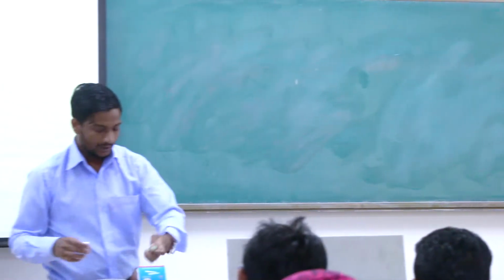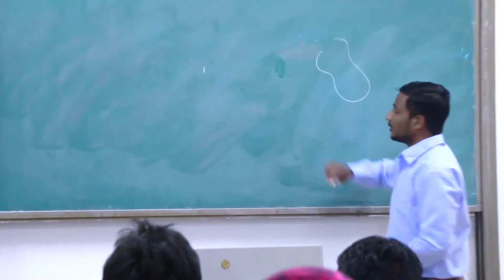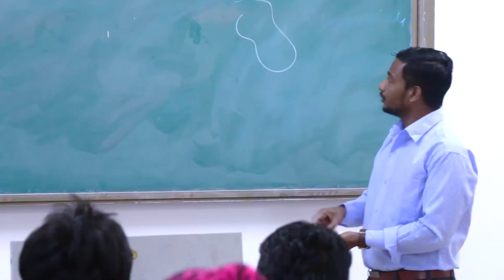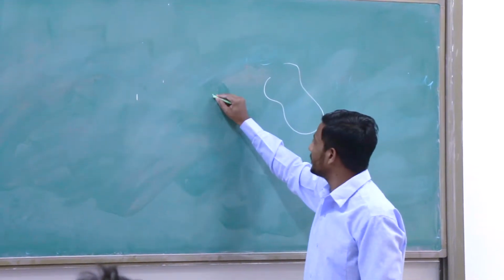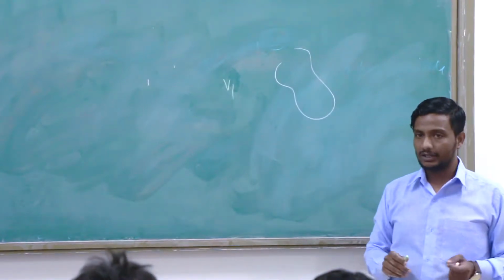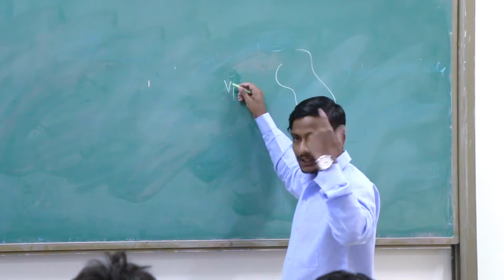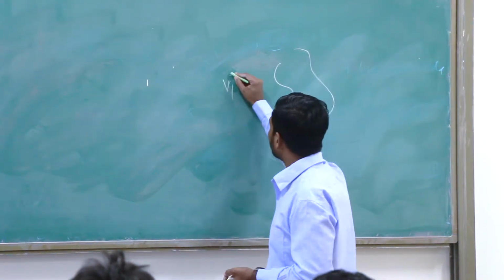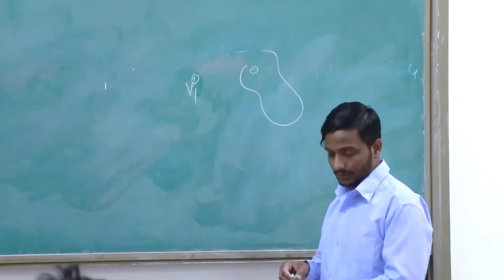Let's go further. Suppose this is your heart here, a very bad looking heart, and now you have your electrodes above it. For example, let's say this electrode is here, called V1, just as one example. As soon as you find the letter V, you have to think that they are working alone. And if they are working alone, they behave as positive, and the center of the body behaves as negative.